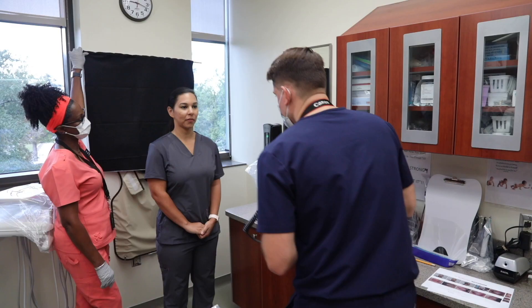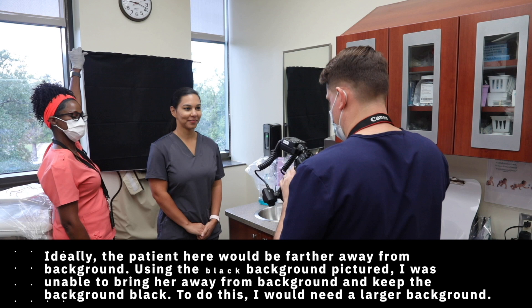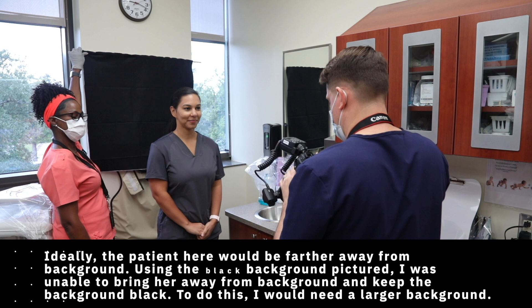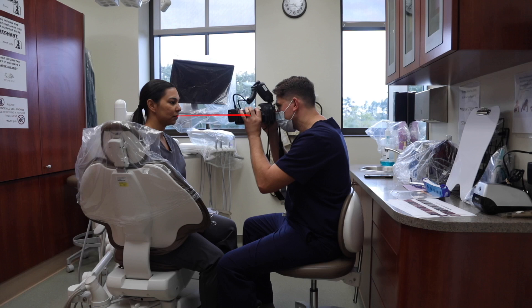For full face shots, I have my patient in front of a neutral background. The background could be white, black, or a neutral color. I take most of my photographs in the operatory where I do my exam, so I typically have the patient stand against the wall. Position the patient to minimize shadows on the background — this will likely require that they not be too close to the wall. Take a photo and adjust their position as necessary. I position myself directly in front of the patient and try to have my camera pointing straight at their face. If the patient is taller or shorter, you should try to figure out a way to make their face even with yours. This may require you to squat down a little, have the patient sit in a chair, or you may need a step stool to make yourself taller.